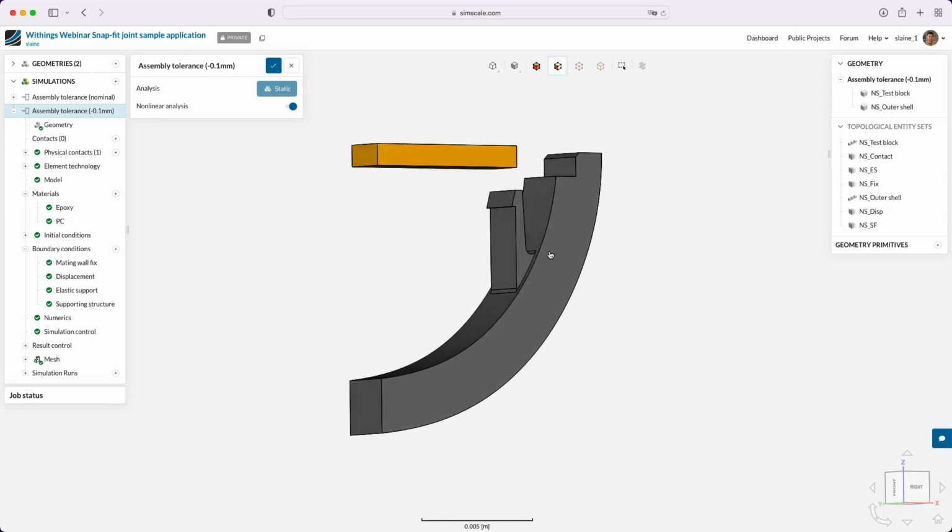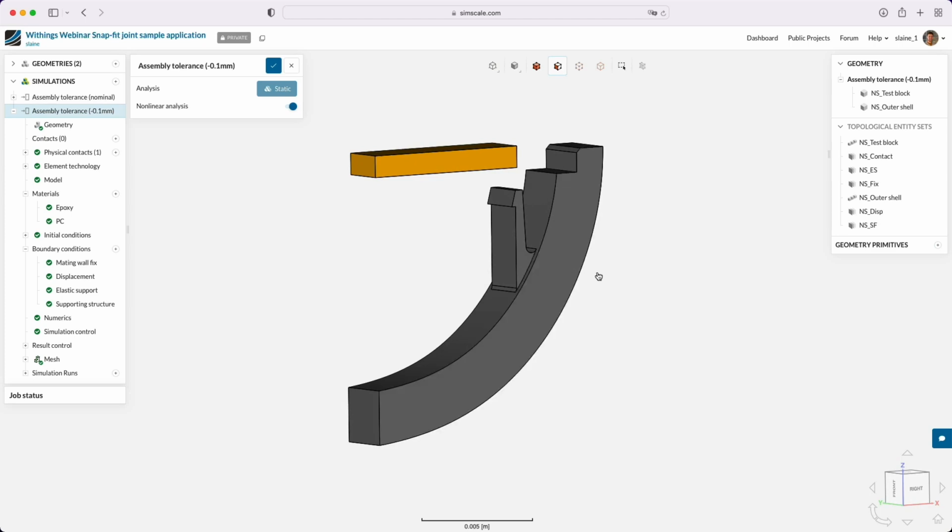And the question that we're looking to answer here with the simulation is, what is the insertion force to insert this connector? What's the extraction force to actually pull it apart? So how resistant is it going to be to coming apart? And what are the effects of different tolerances?